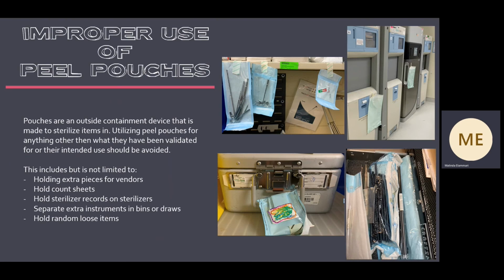Additionally, if you look at these pictures, the other situation we face is where everybody's using tape to hold everything onto their equipment and onto their workstations, and we wind up getting a buildup of adhesive. And in that buildup of adhesive, we just give microorganisms a nice place to grow and create communities and make homes and open businesses and everything else, right? So we don't want to even invite that or provide that situation. And the way to do that is not sticking tape or having adhesive on your workstations or work areas.